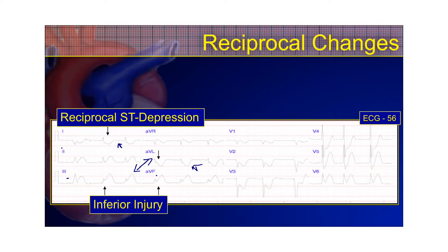If you look over at the precordial leads, all this ST segment depression you see is not a reciprocal change to the inferior leads. That's actually a reciprocal change to the posterior wall, which is often involved with your inferior wall MIs because of the way coronary circulation works.